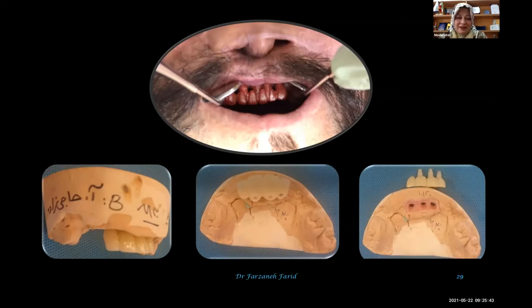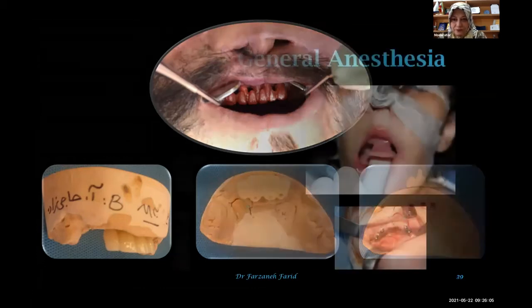It means that we can't have any conventional treatment for the patient because the direction of the abutment would be completely different from the direction of the crowns. So here again, digital technology helped us to give the patient something to have inside his mouth.